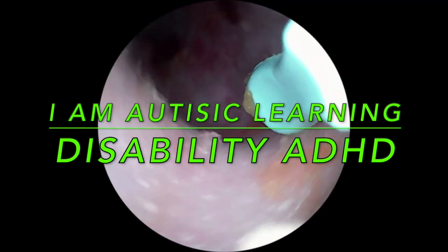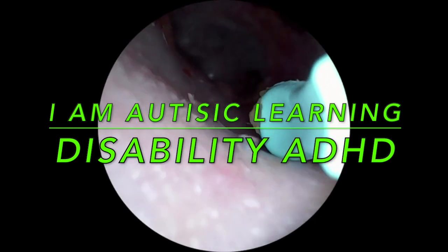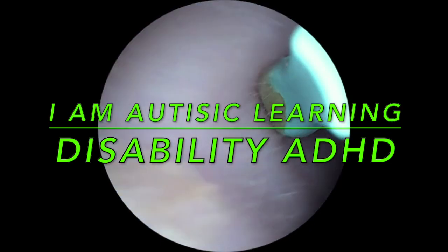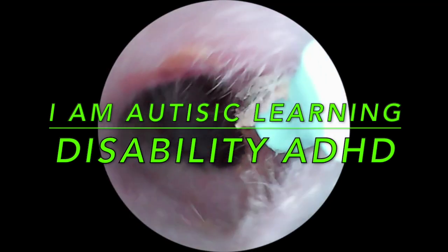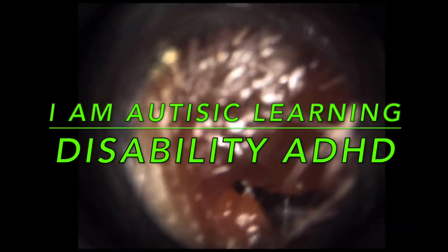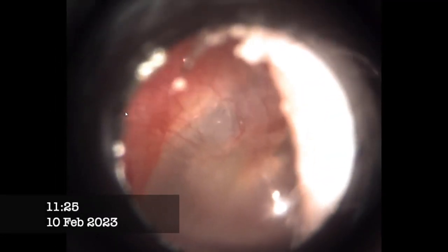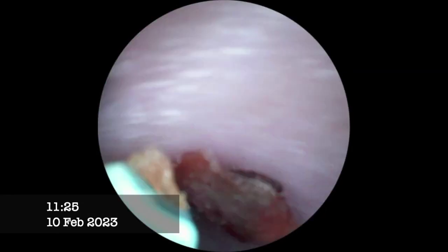So naturally, after Heather experienced pain by Chris using this tool on her ear, we decided to stop the experiment altogether, and don't worry, Heather's okay. After the failed earwax removal attempt, I safely removed Heather's earwax in the right ear. I was also able to remove the remaining earwax in her left ear following the partial removal using the video endoscope. Here's a before shot of Heather's right ear canal before using the endoscope. Following professional removal of the wax in Heather's right ear, you can clearly see that Chris inadvertently scraped Heather's ear canal and irritated her eardrum by pushing the earwax into it.